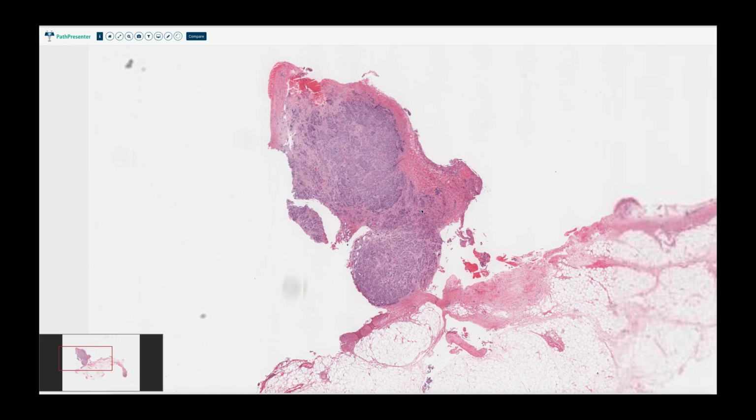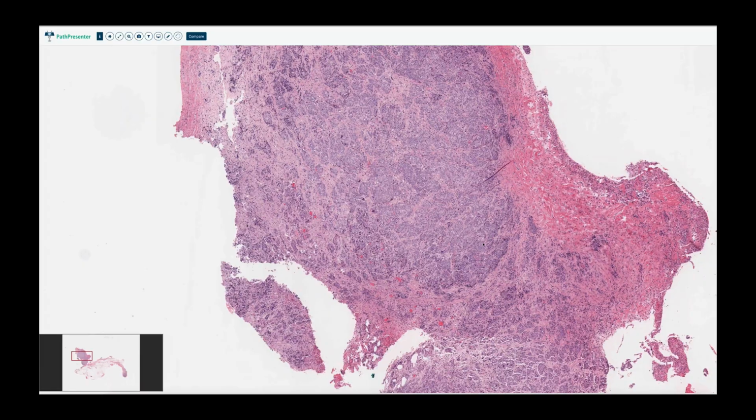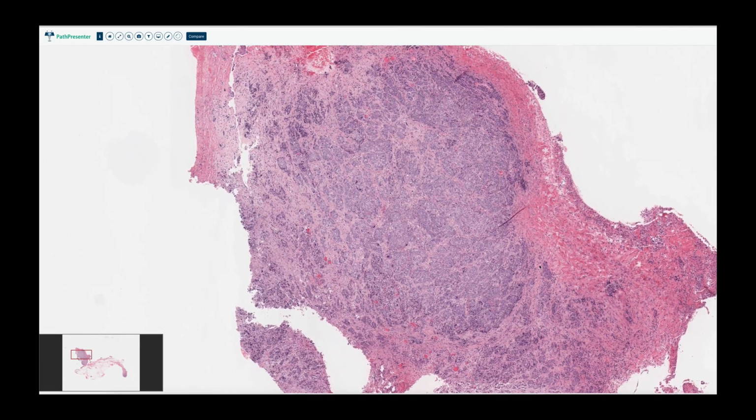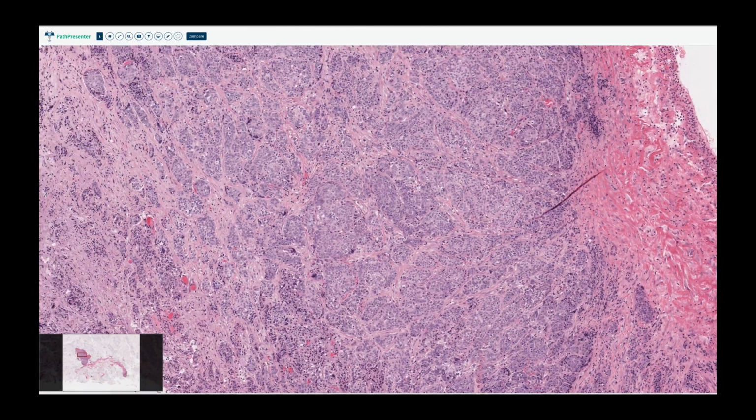The idea being that if you don't leave behind big pieces of tumor, whatever you might happen to leave behind, the microscopic foci that you can't see with your eye, can be taken care of with cytotoxic chemotherapy, which is given after surgery. So this is an example of high-grade serous carcinoma, so not the low-grade that we were just looking at. Those invasive foci had that morphology.